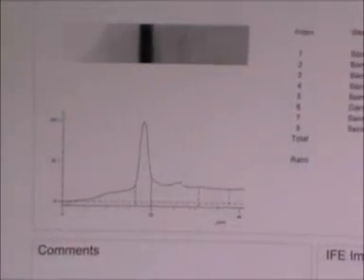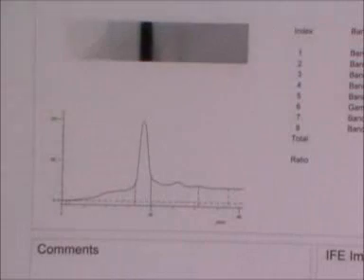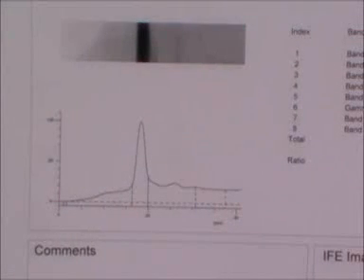Track 7 shows a strong haemoglobin S band that runs between A2 and A.